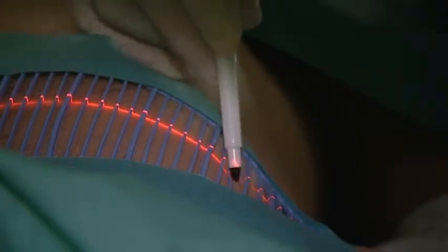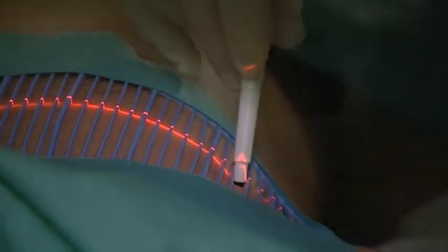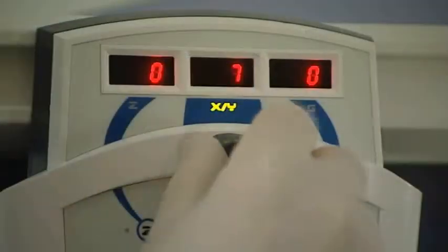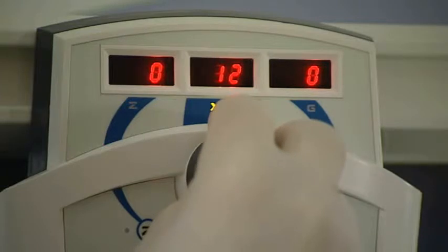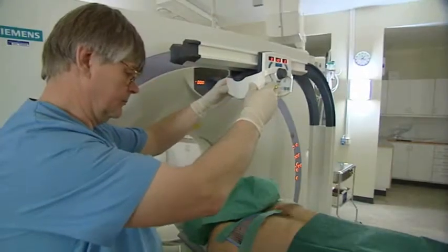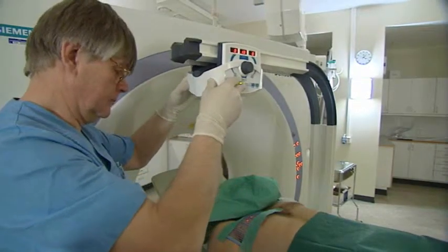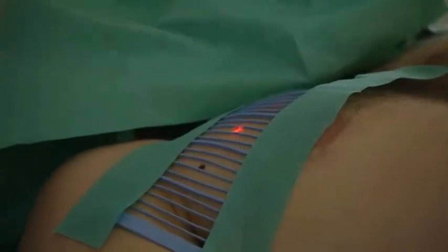After marking the skin entry point, the calculated angle is entered into the Simplicity by rotating the angle input wheel. By moving the laser unit, the laser dot is brought over the skin entry point.